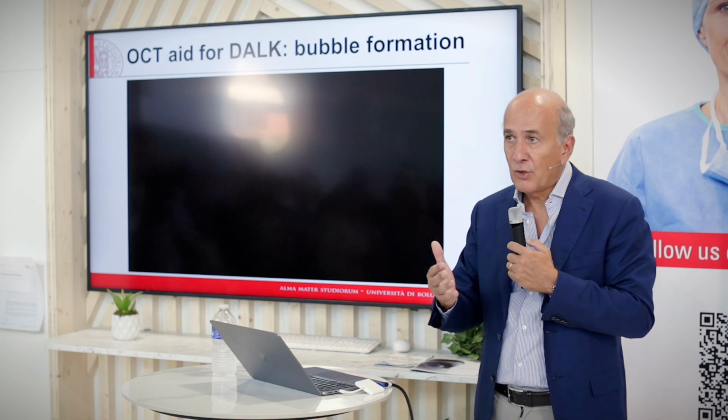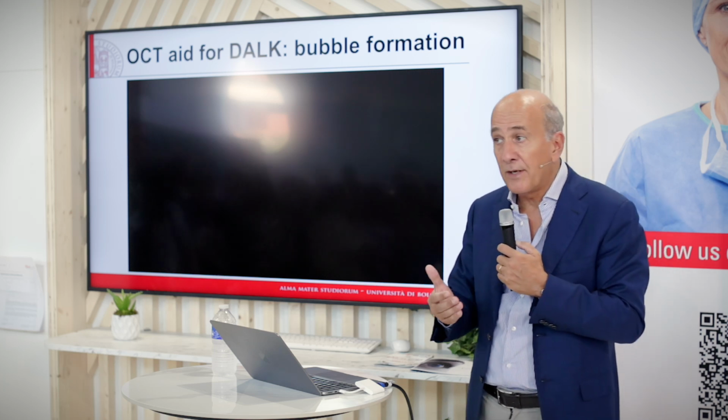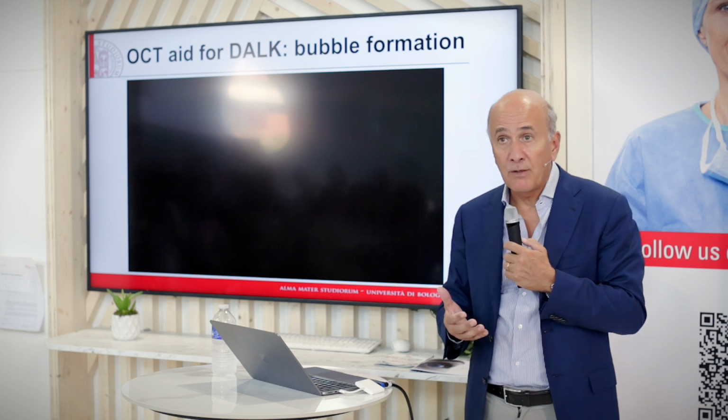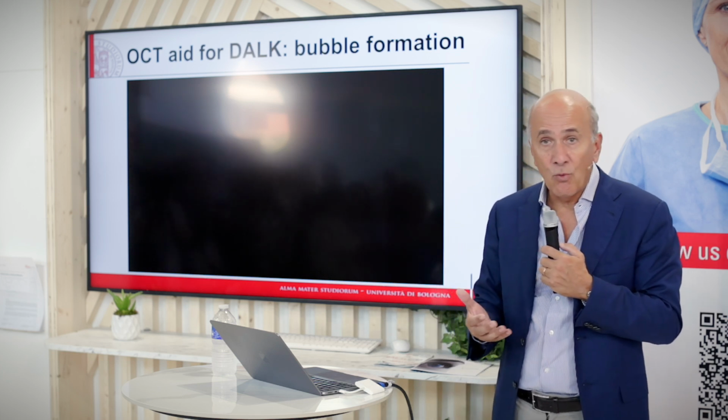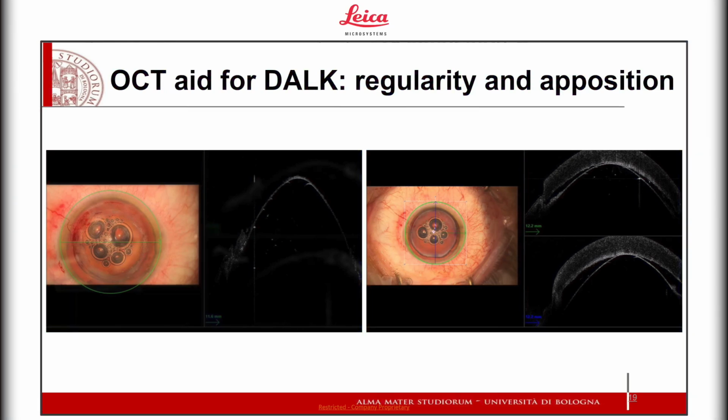Okay. So there are fewer surprises on the following day regarding whether you may have a double chamber, things that you really don't want to have. So here are some examples, okay?